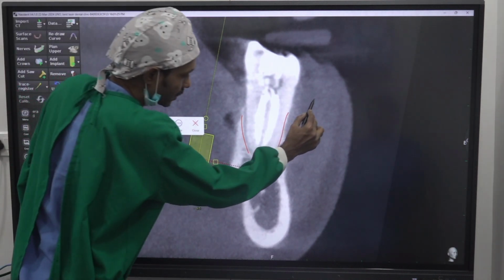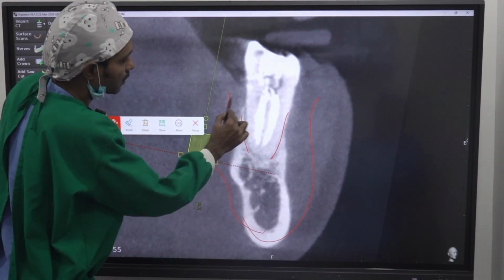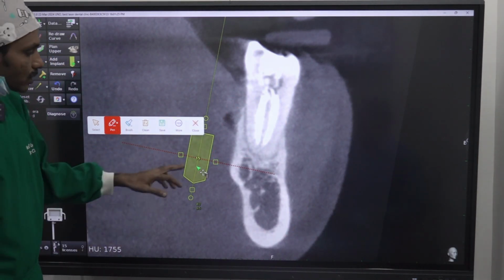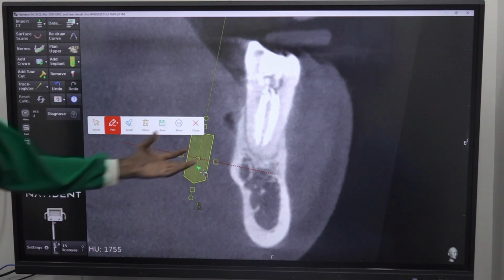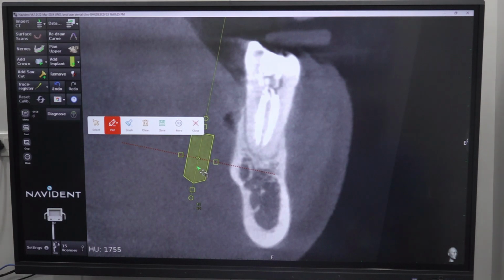By nature itself, if the patient is having bone like this, right, or something like this, there will be a lot of bone here. But here, the lingual plate is very thin. So these are the anatomic variations we should see. The entire root is occupying the socket. Imagine you are removing this tooth, there is nothing left in the socket. These are the challenges in 6.